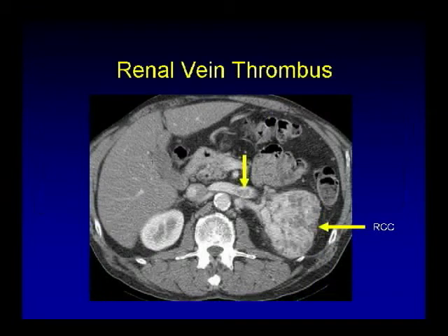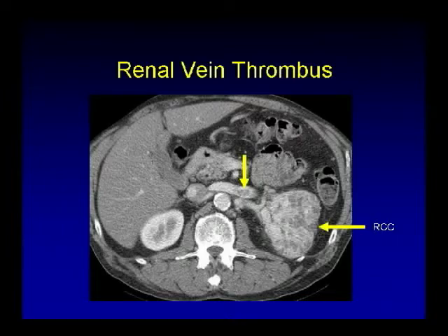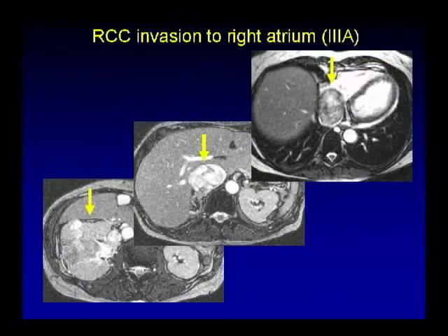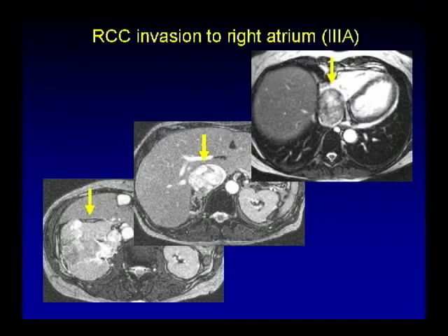Here's another CT case: solid enhancing left renal mass consistent with RCC, and the left renal vein tumor thrombus — again renal vein invasion. Here's an example on MR of right renal cell carcinoma, and then tumor thrombus in the IVC extending all the way into the right atrium. It's important to let your surgeons know because the surgical management is different.